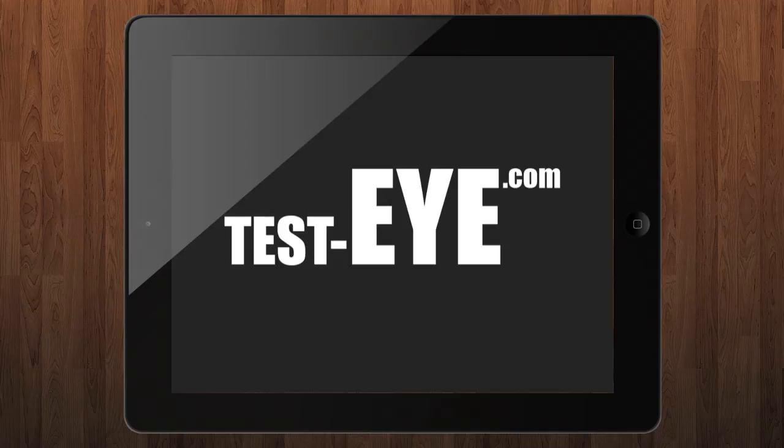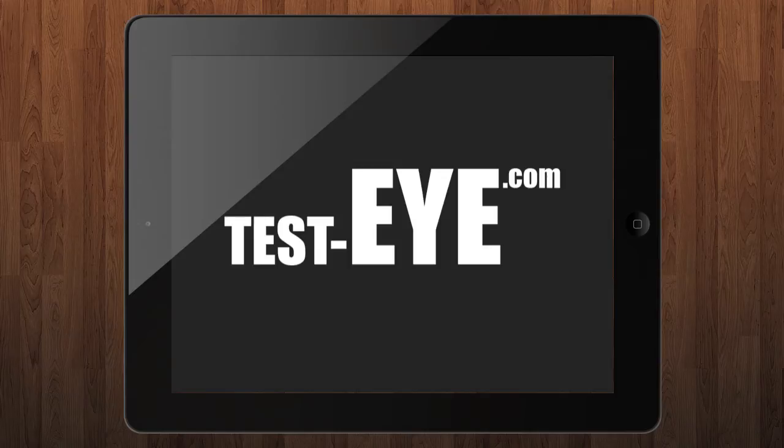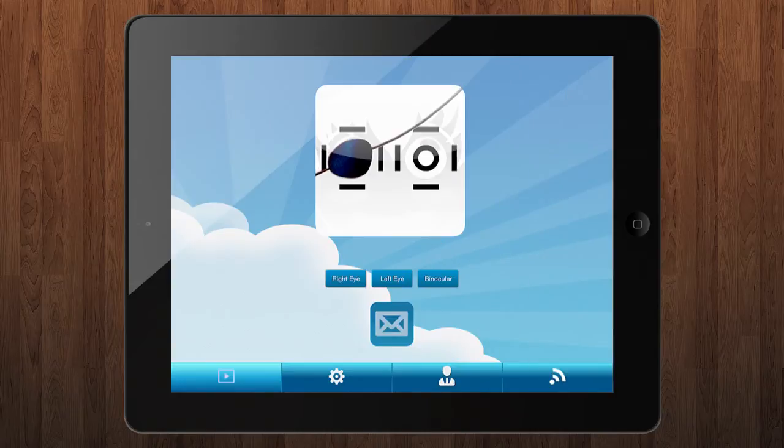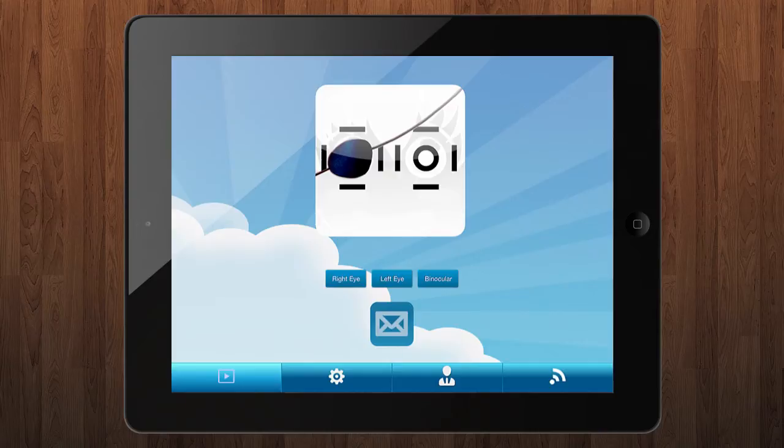Hi and welcome to test-eye.com. My name is Manuel Rodriguez and today I would like to introduce you to some of the new great features that I have added to the Amblyopia Visual Acuity application for iPad and Android tablets.